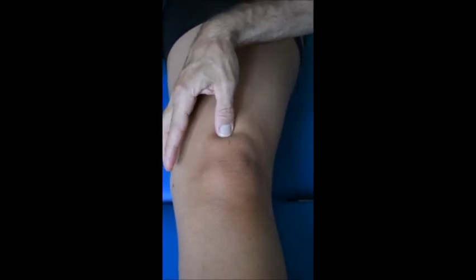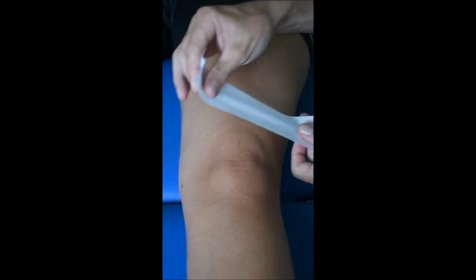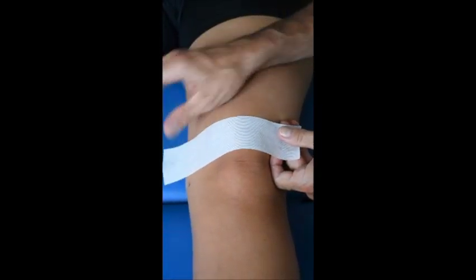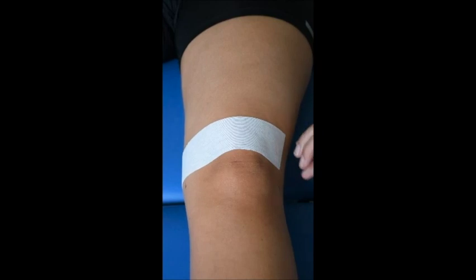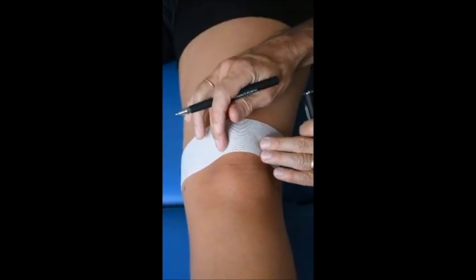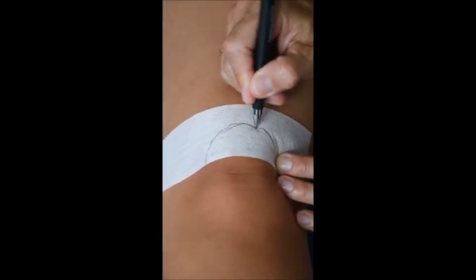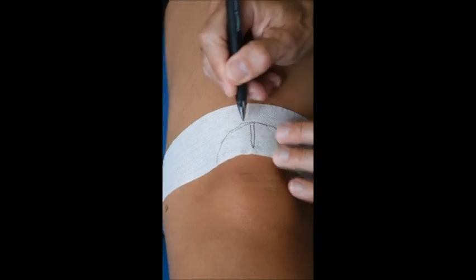So the superior border of the patella is here, the inferior border is here. So we place the tape a little bit higher. Again, a little bit lateral, more tape medially. Make sure now you divide your patella in 4 positions.